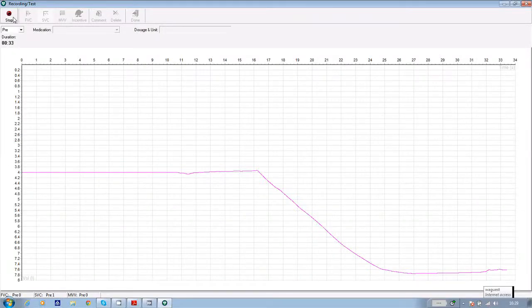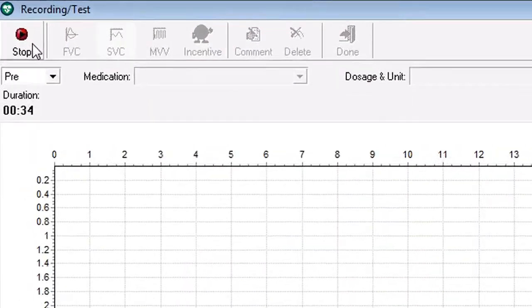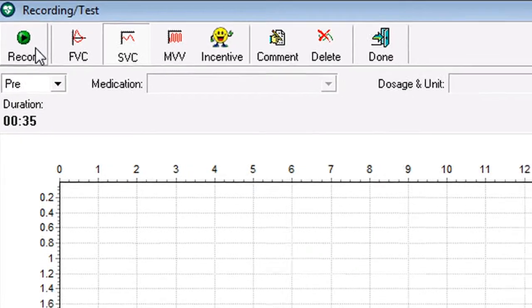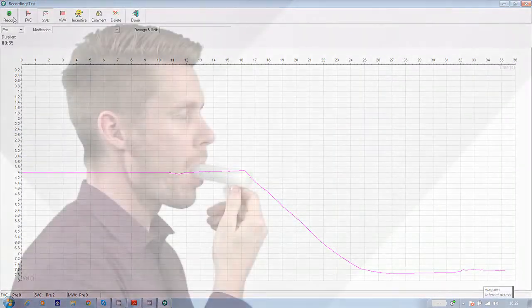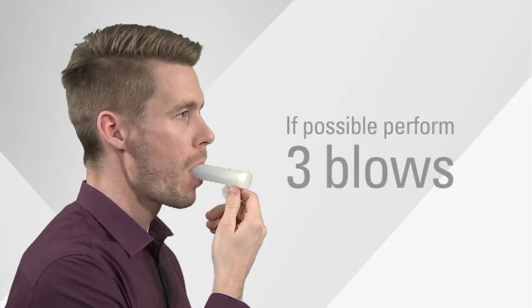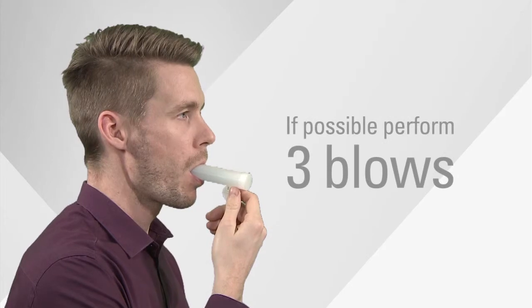When the patient's completed the effort, click on stop and the test is logged. If possible, you should do three of these blows.